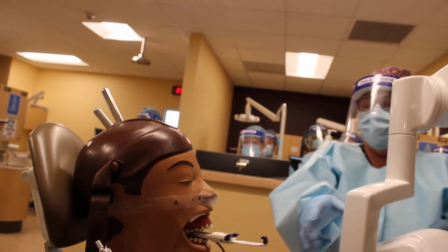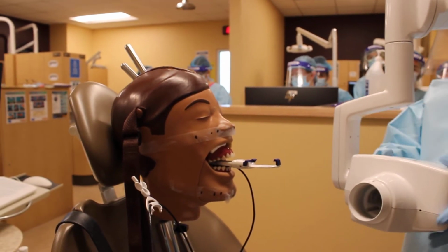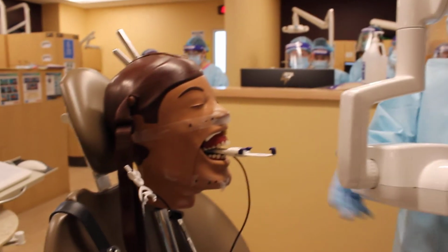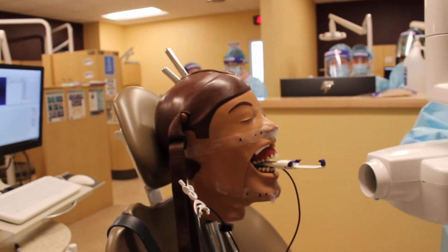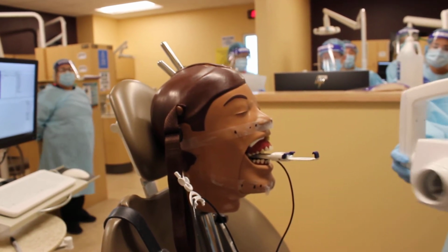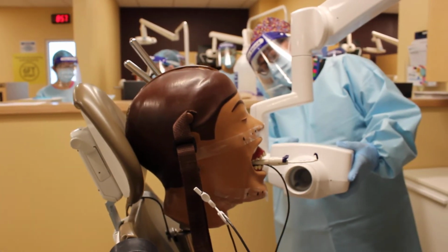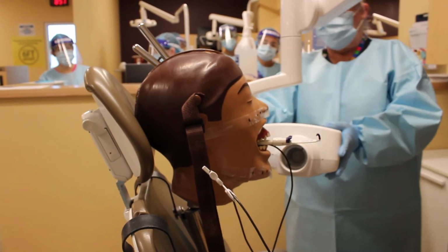So, and this, if it doesn't go, flip it around and turn it. Don't force this, because if you guys saw the way I was having it, it wouldn't go. So they just flip it. Don't force these things. Negative 10? So it's not much angulation.